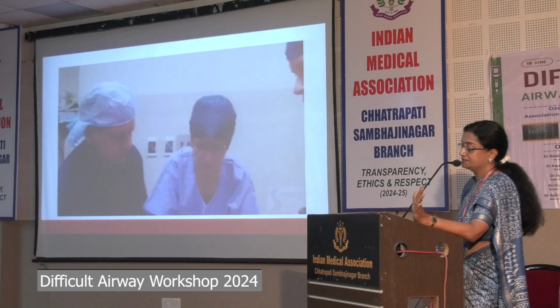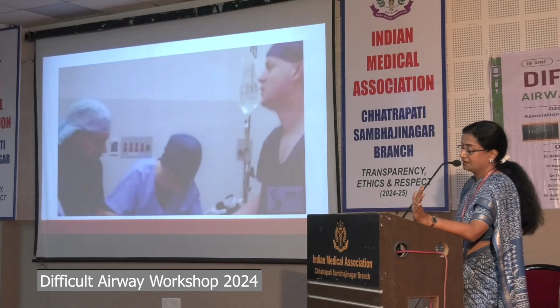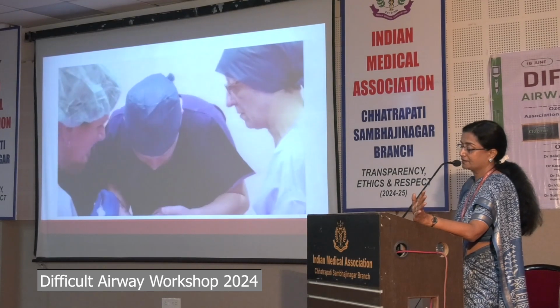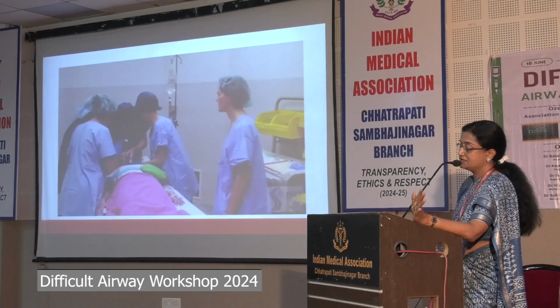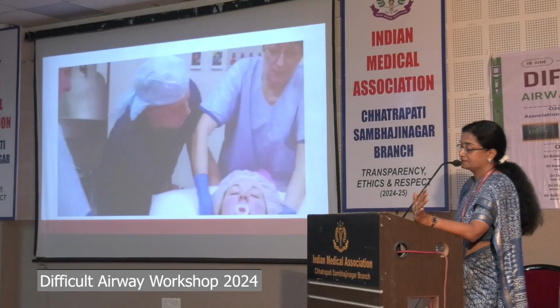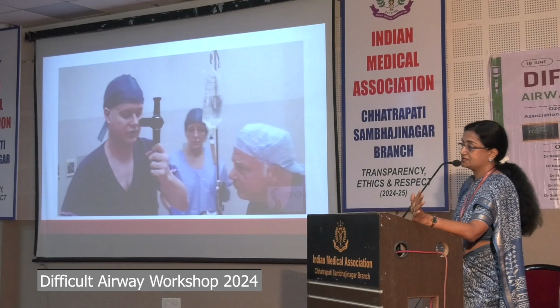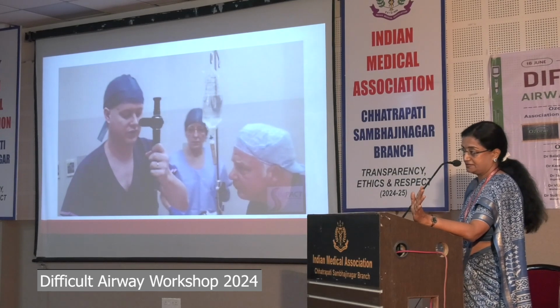See the trauma. Now they change hands. There is bradycardia, hypoxia. Okay, he too cannot intubate. They had a fiber optic there. This patient landed up brain dead, and 13 days later, she died.